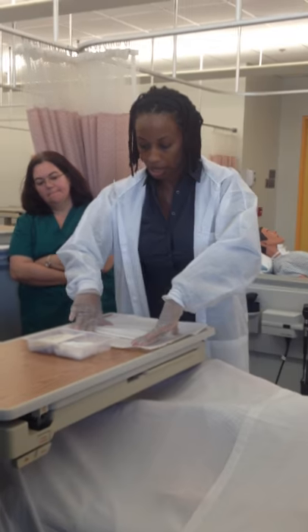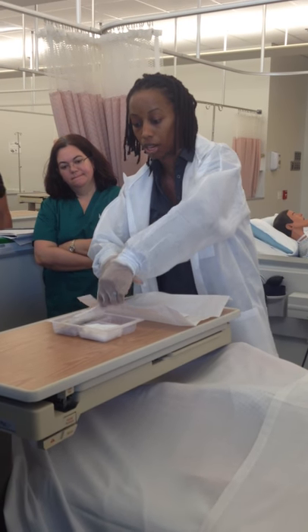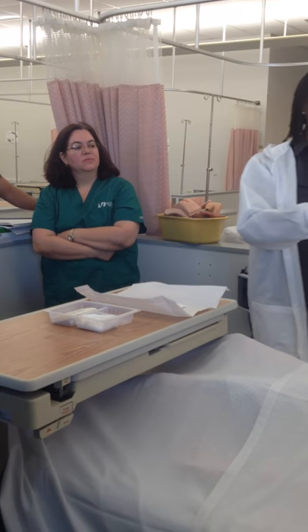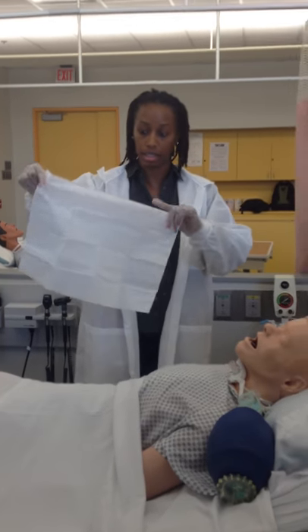I want to go ahead and put a drape down because whenever you suction, you never know if you're going to get a mucus plug. I'm going to pull it from out of this tube because my hands are sterile. Now in the video, the sterile portion is when you actually suction your patient — shiny side down.